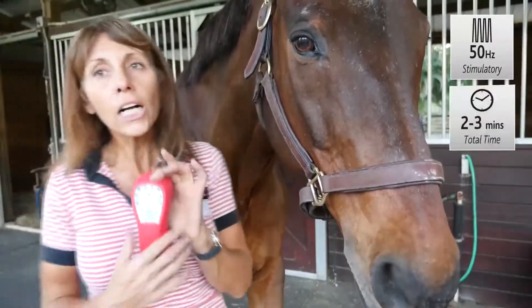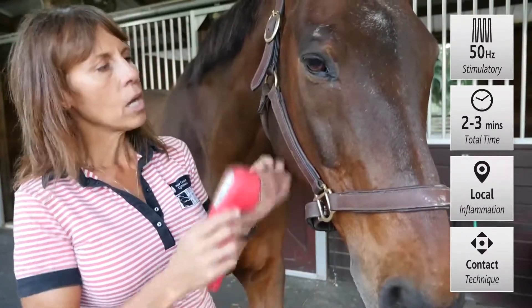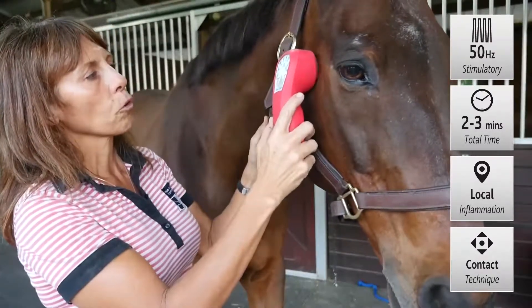It's a stimulating treatment that we're doing. So we're going to turn the unit on again, get to program number one, and then we would just directly treat right over those nerve roots.